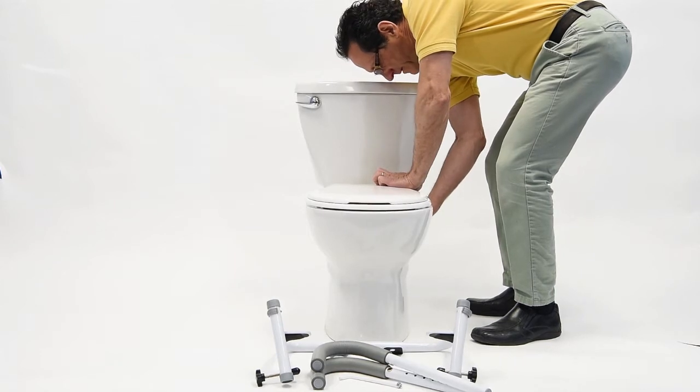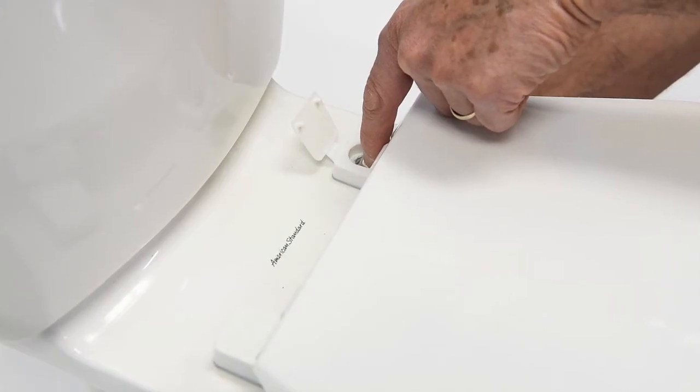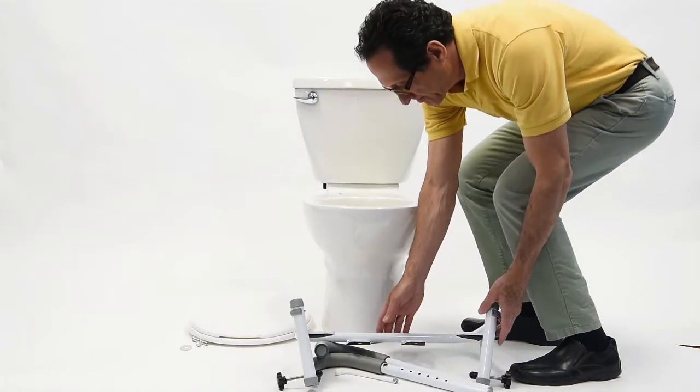Assembly is easy and you can use your existing toilet seat for seamless integration. Start by removing the hardware attaching your existing toilet seat. Once your toilet seat has been removed, place it off to the side.